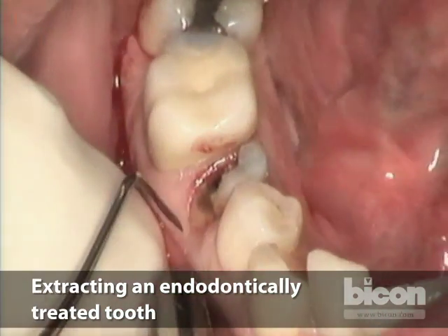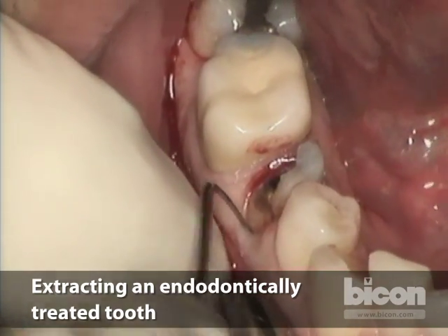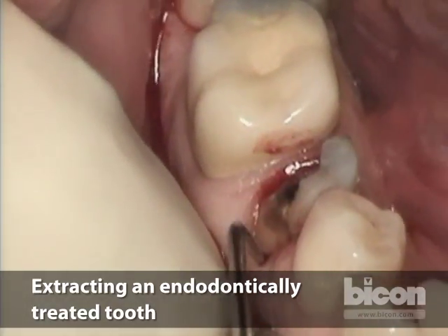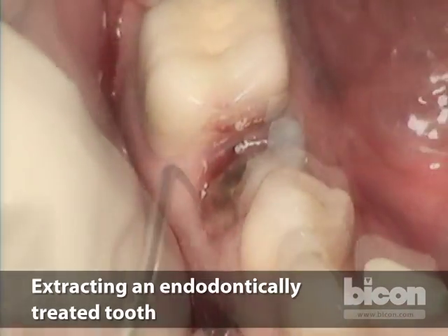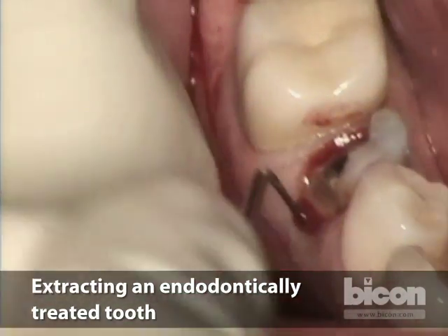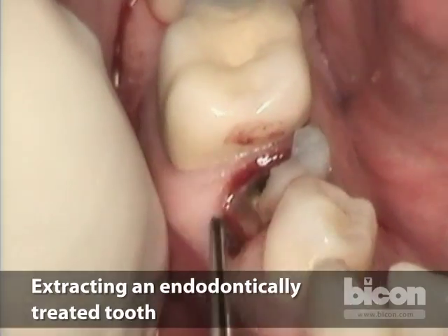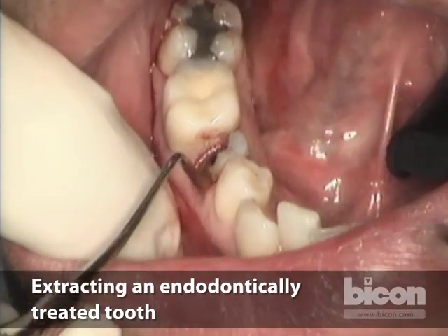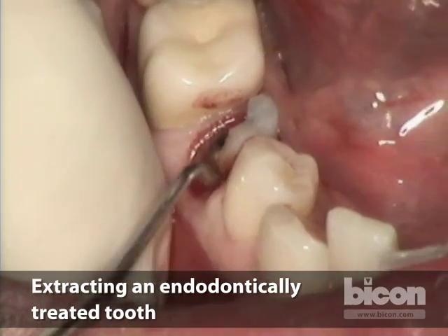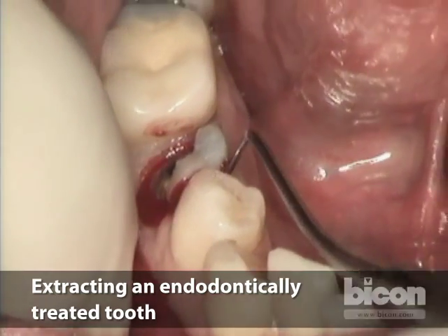The advantage of using periotomes, as I'm doing now, is that you can go in between the buccal plate — which is extremely thin in many cases — and the root without risking serious damage to the plate itself. With this apical displacement, we go right down the surface of the root and gently and systematically sever all of these fibers.